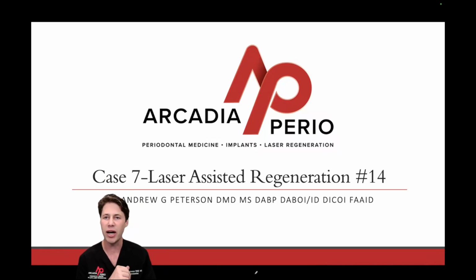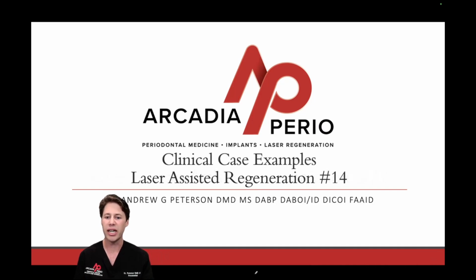Today's case we're going to talk about is a localized periodontal defect on tooth number 14. Have you ever run into these types of defects with furcation bone loss and not been sure what to do? Well, here's the way that we treat these cases here at Arcadia Perio. So sit back, relax, and let's dive in on tonight's presentation.